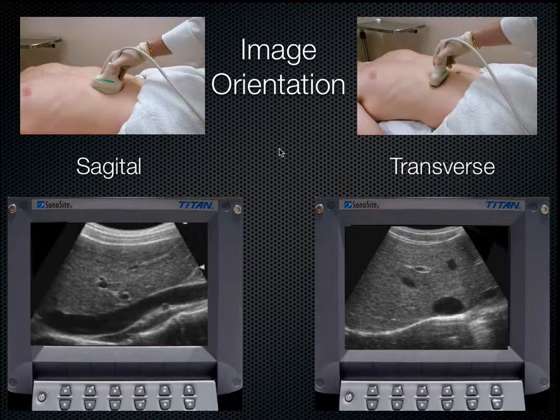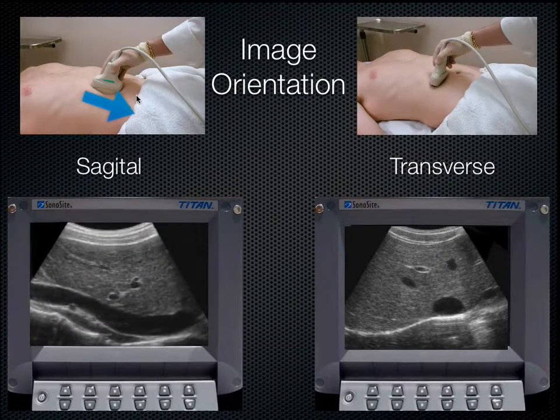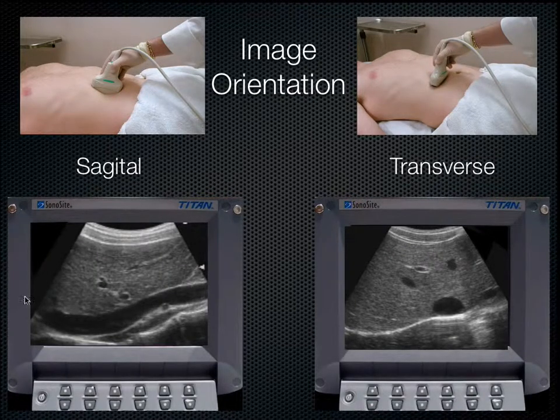Now, what if I accidentally aim that indicator towards the patient's feet? Well, you may look at this and go, no big deal, it's just upside down, but there's the IVC, I see it moving there. But to me, that's like fingernails on a chalkboard, and I'm going to flip it back the other way. So this is to the head, and this is to the feet.